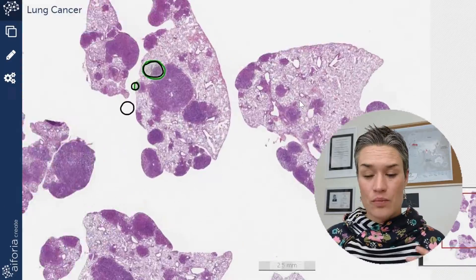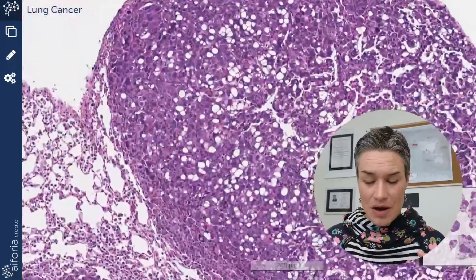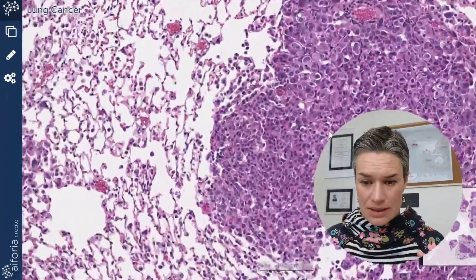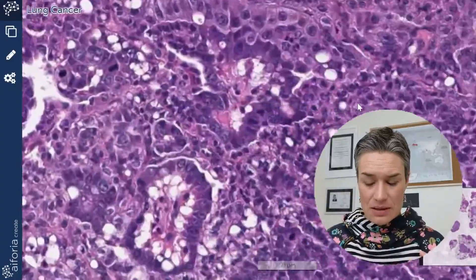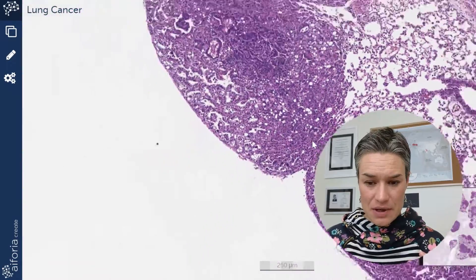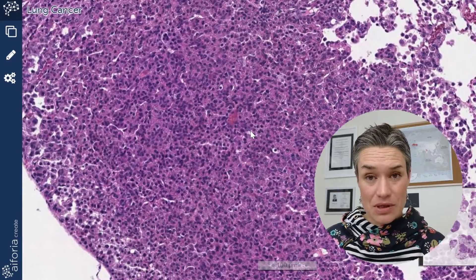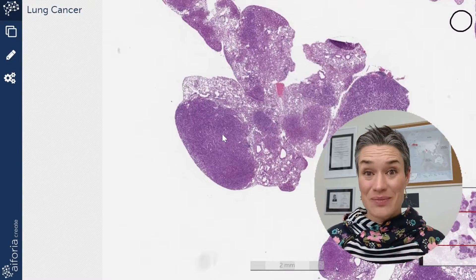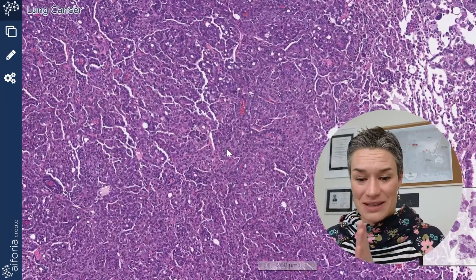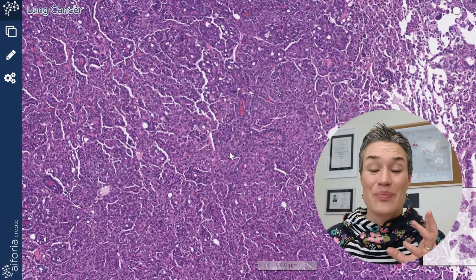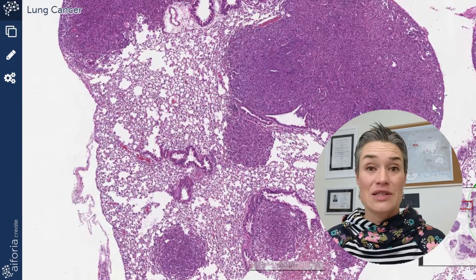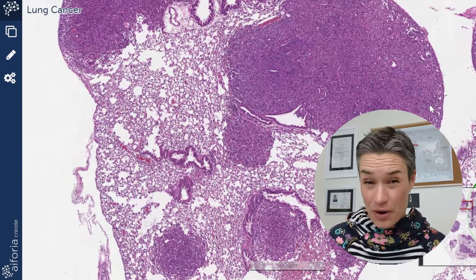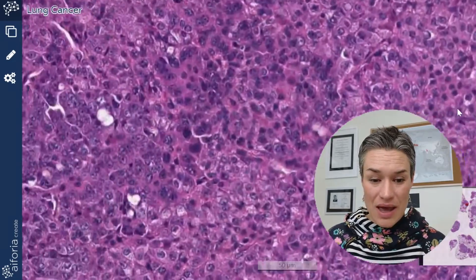By this time we should have covered every aspect of what our tumor looks like — different types of cells, different types of structures, vacuolation. They all look similar to us and we know this is tumor. But the model needs to be trained on every single aspect and shown the pixel composition through our annotations. We need to keep our ground truth documents updated with each new appearance. And we have our ground truth playbook ready for future projects.